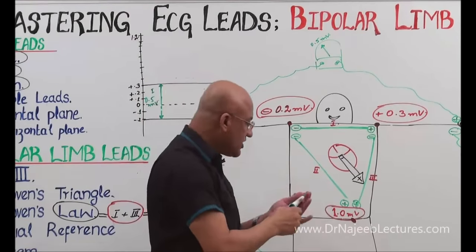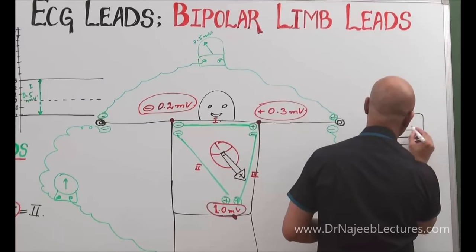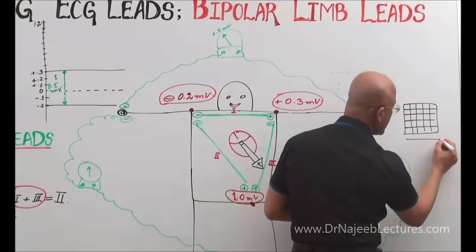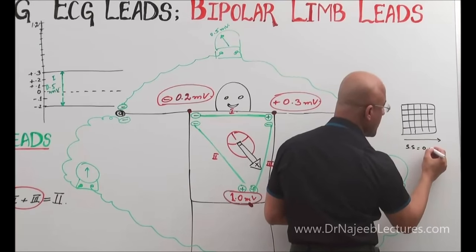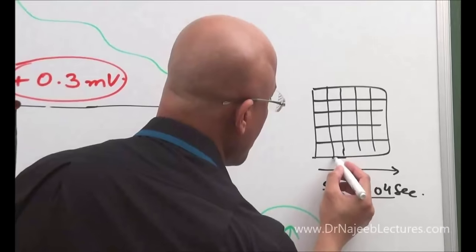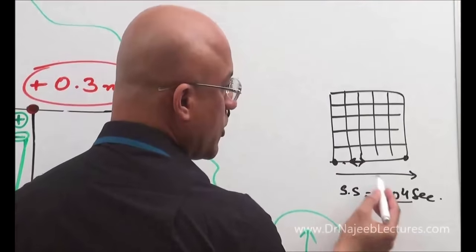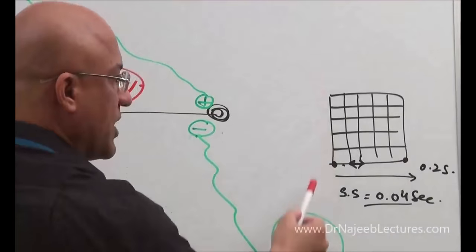Now, on ECG paper, as you know, there is a big square, is that right? Yes. Now, the grid of the ECG paper, now I'm making. Here on the x-axis, horizontal, this is the time. One small square is equal to 0.04 second. I have explained in the previous lecture that this small square represents 0.04 second, or a big square represents 0.04 second into 5, 0.2 second.